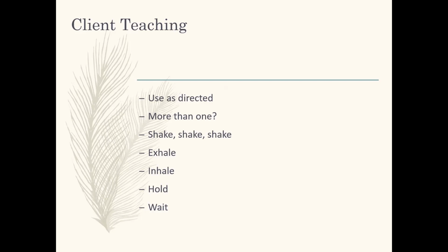Some books say 1 to 2 minutes, at least 1 minute between the first puff and the second puff of the same medication. If they're taking 2 medications, they need to wait at least 1 to 5 minutes between medications. Some of your information varies on if it says 1 minute or 5 minutes. The key thing is it's at least 1 minute wait and then use that other medication.